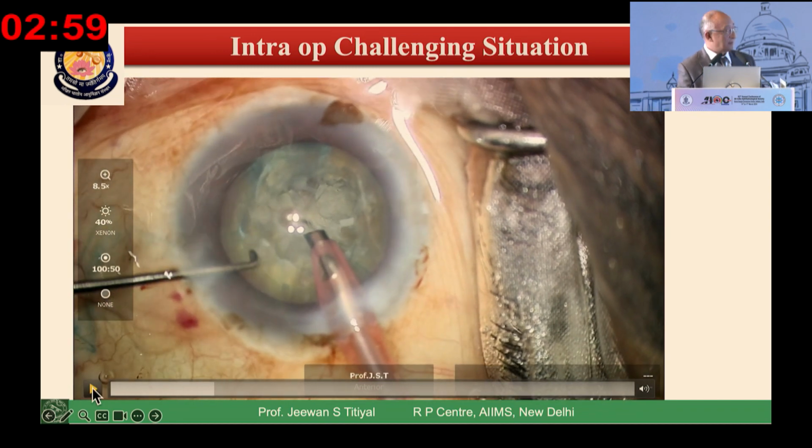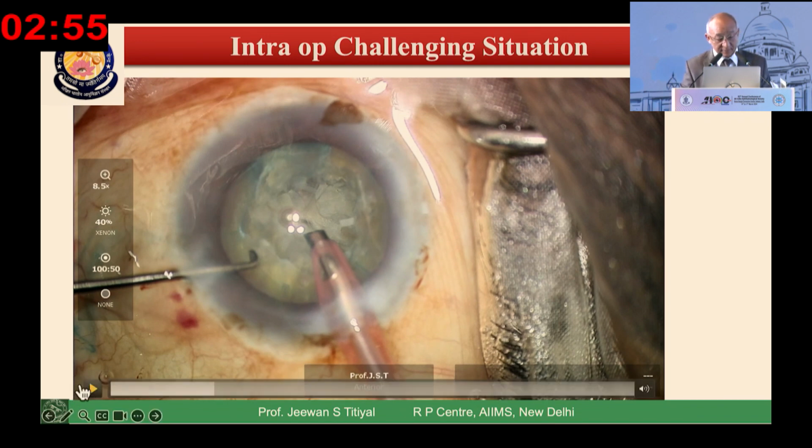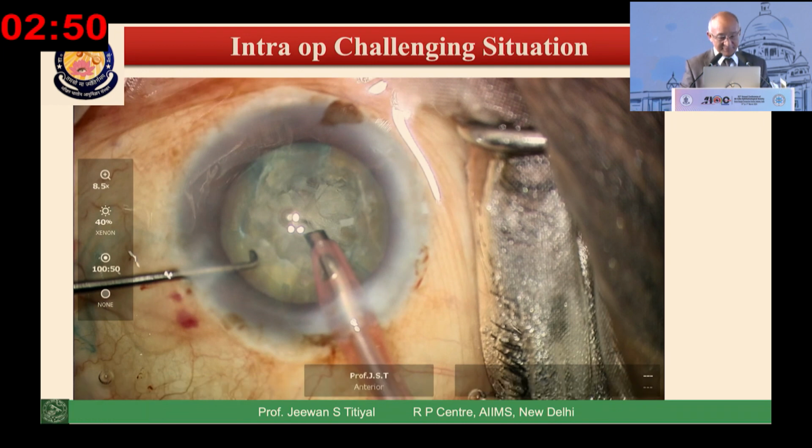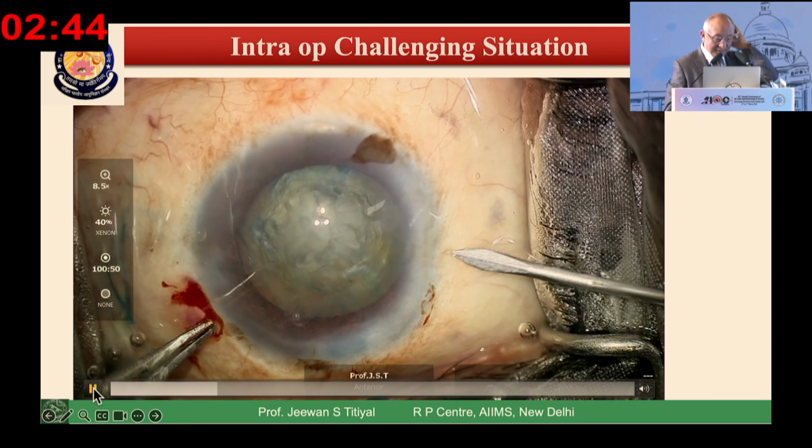Capsular hooks. Capsular hook on the capsule. Okay. Only capsular hooks or endocapsular? I think first step would be capsular hooks. That itself will stabilize the bag. Then you can plan about the CTR.